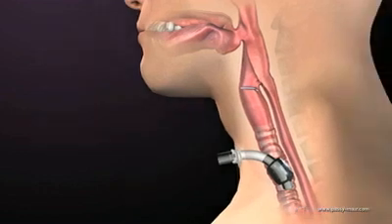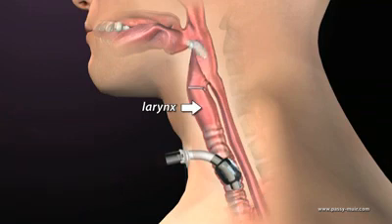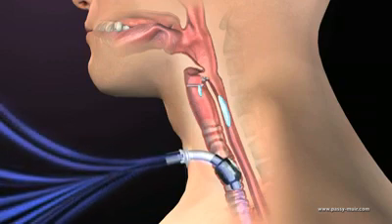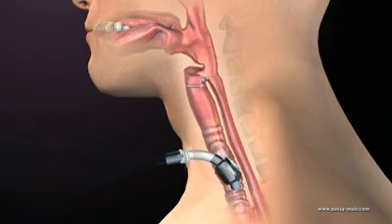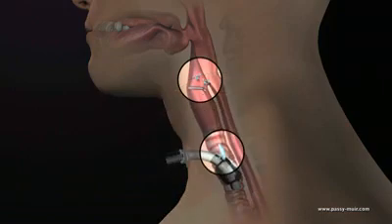The cuffed tracheostomy tube may anchor the larynx, interfering with laryngeal elevation, epiglottis inversion, and airway protection. Because air escapes through the tracheostomy tube when the vocal folds close, positive subglottic pressures cannot be generated during swallowing. Reduced sensation in the larynx and pharynx leads to pooling of material in the airway, and also reduces the protective cough reflex, which is necessary to clear the larynx and trachea when penetration and aspiration occur.